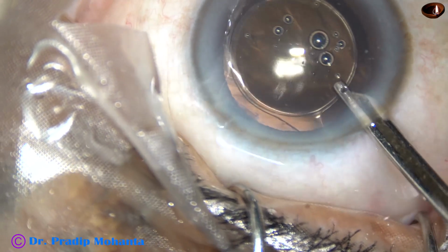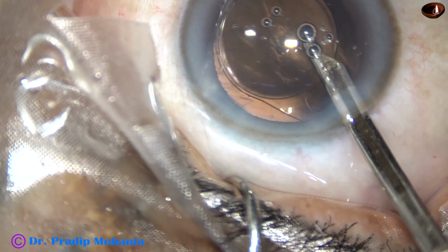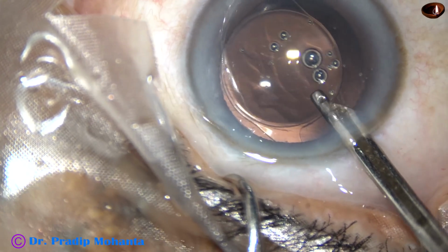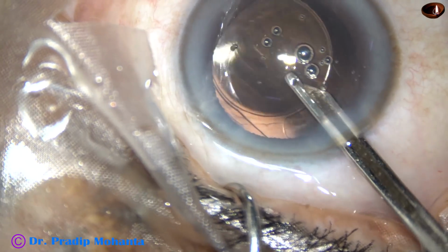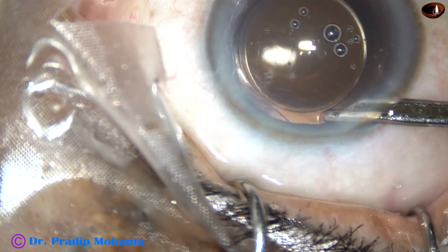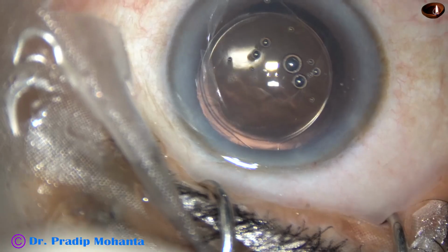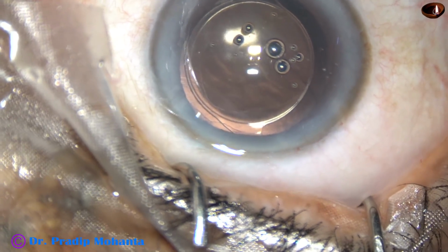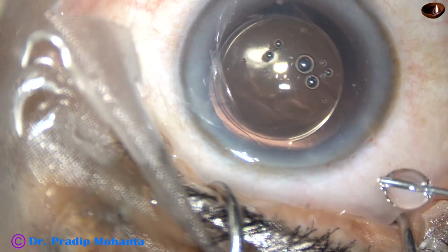Now I go behind the IOL, and as I aspirate, see, this bolus of viscoat comes out. Since this is a combination of sodium hyaluronate and chondroitin sulfate, it remains in a bolus and it comes out easily. And now I am very much relieved because there is no vitreous prolapse. Vitrectomy has not been required. That is a great thing.